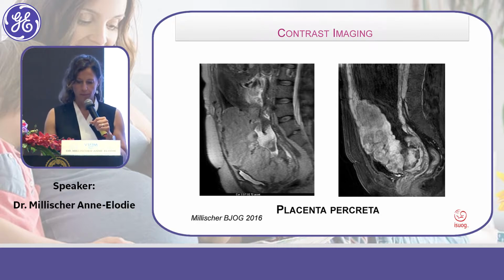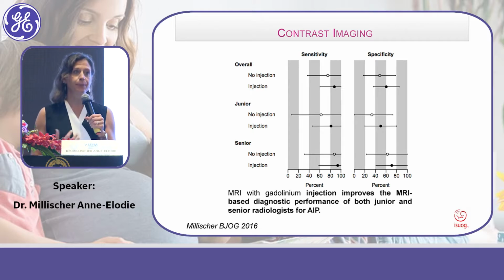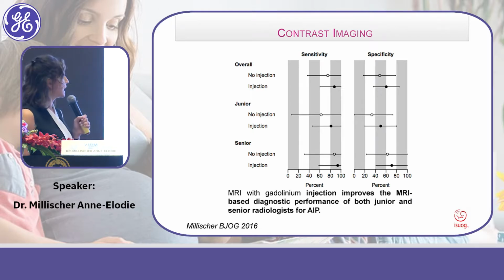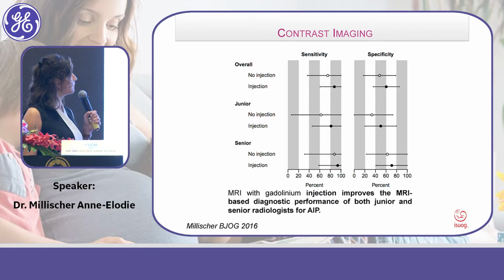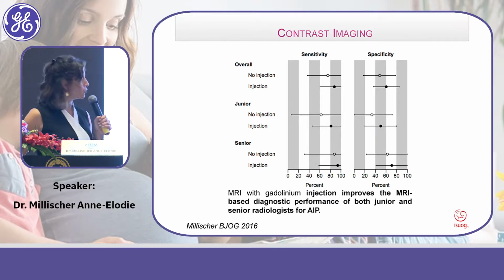And we demonstrated that for junior radiologists, with radiologists who are not very experienced in this pathology, the adding of contrast imaging helps them to do a more reliable diagnosis.